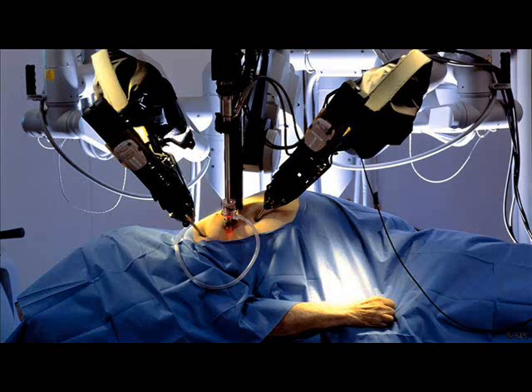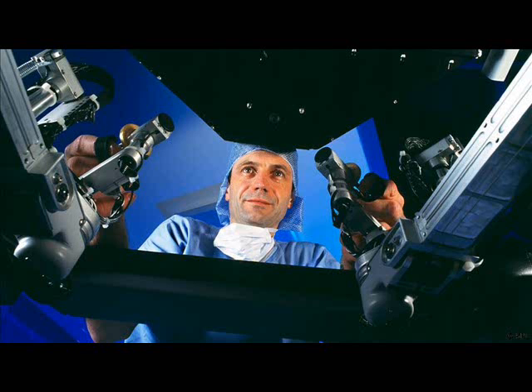Another example is the Caspar robot produced by U.R.S., which is used for total hip replacement, total knee replacement and anterior cruciate ligament reconstruction. Mako Surgical Corp produces the Rio, which combines robotics, navigation, and haptics for both partial knee and total hip replacement surgery. Blue Belt Technologies received FDA clearance in November 2012 for the Navio surgical system. The Navio system is a navigated, robotics-assisted surgical system that uses a CT-free approach to assist in partial knee replacement surgery.